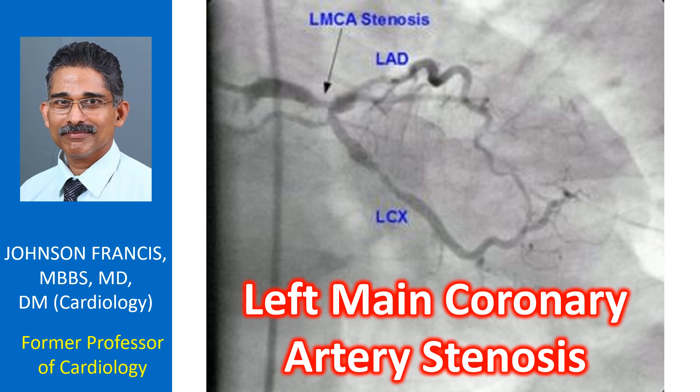Significant left main coronary artery stenosis was conventionally an indication for coronary artery bypass grafting. Here the left main coronary artery stenosis is evident just proximal to the bifurcation. Significant stenosis is seen in the left anterior descending and left circumflex coronary arteries.